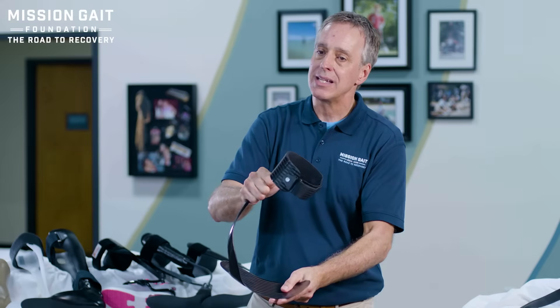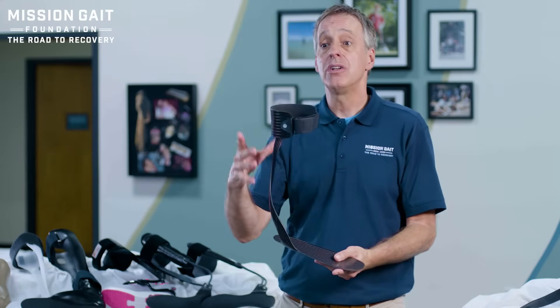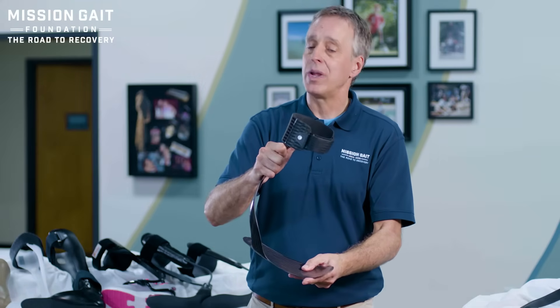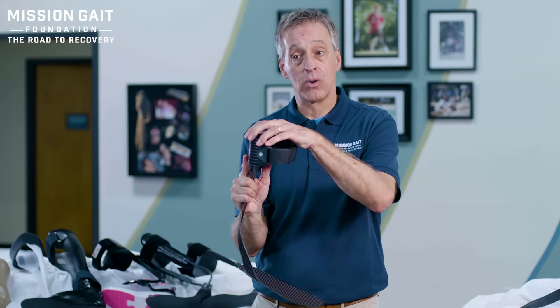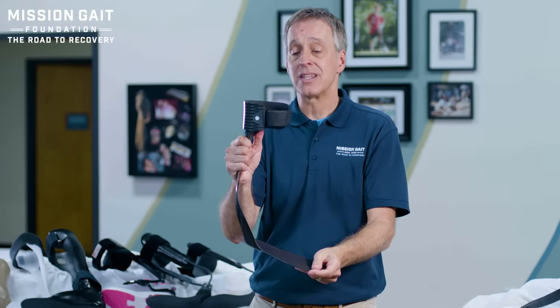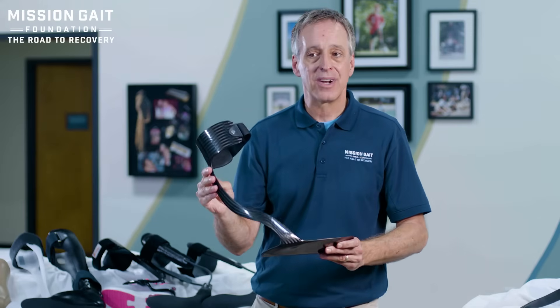This floor reaction brace is affixed, holds your foot up, stabilizes your foot, and as you roll forward, it bends and returns that energy to you — as you press into the ground, it gives you the energy back. If you have a strong quad, no tone issues, and a weaker calf, this will help you propel and move forward. Neuropathy patients do well with this. But if you have tone where the knee goes into hyperextension, this device will force the patient into hyperextension — a really cool brace, but not the right brace for that particular patient.